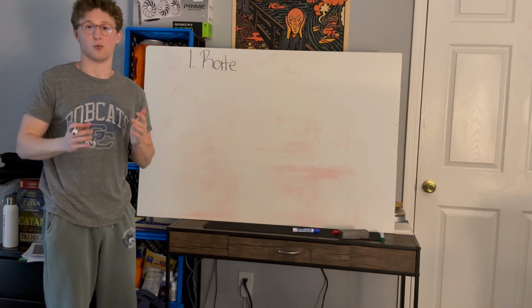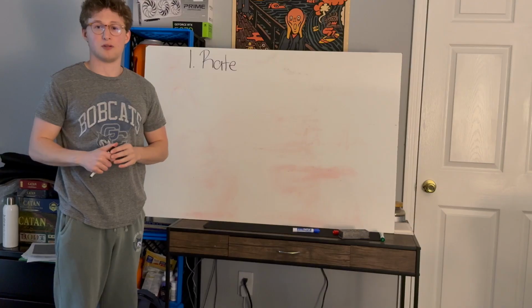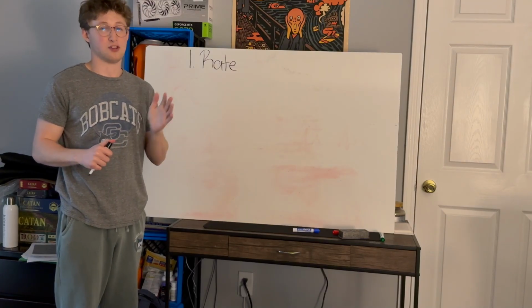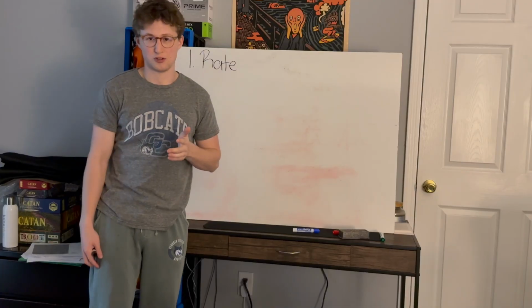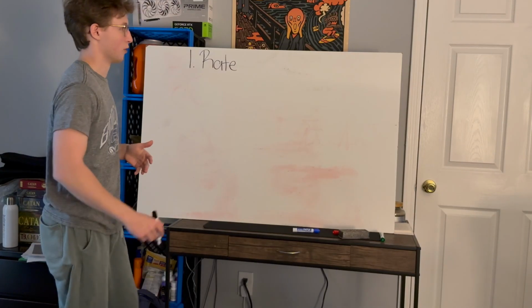Step 1, rate. First thing you do, figure out, is this heart rate bradycardic, less than 60? Is it normal? Is it tachycardic, above 100? There are 3 ways you can do it. There's more than 3, but there are 3 general ways you want to do it.